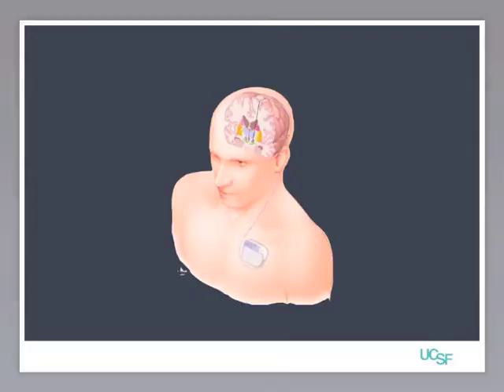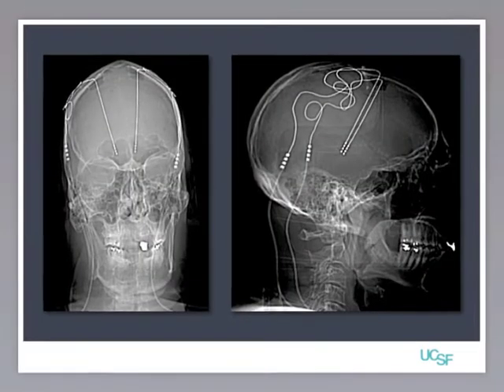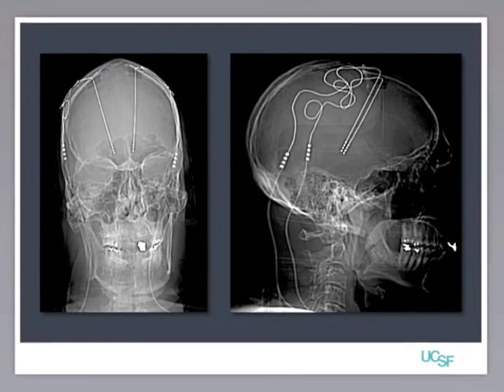So, DBS is short for deep brain stimulation, and it's essentially a pacemaker for your brain. It's a completely implanted device. There's a schematic of what it looks like. It's 1 or 2 electrodes that are implanted in a specific part of the brain that we know is involved in Parkinson's disease. And that wire is connected to a little battery pack, or what we call a pulse generator, that sits underneath the skin, usually right below the collarbone in the chest. And this battery sends little electrical signals to the electrode in the brain, and it can improve some of the symptoms of Parkinson's disease.